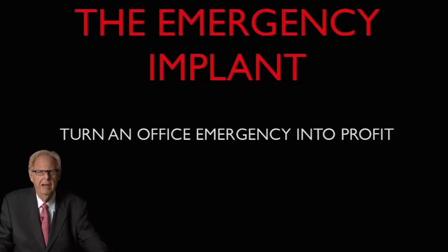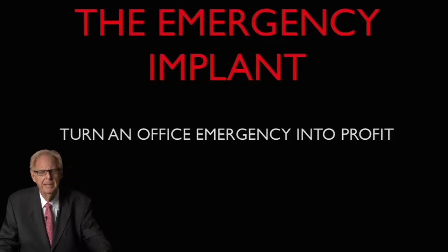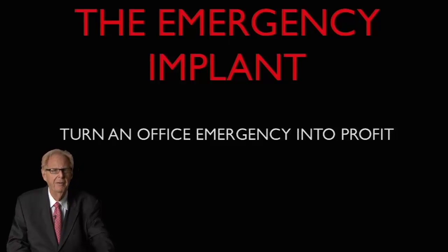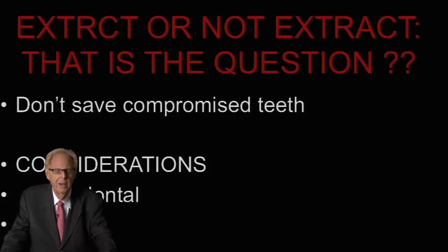So when presented properly, the implant option of a dental implant is the best option for that patient, because if you present a 3-unit bridge and tell them that you have to prepare adjacent teeth, or the possibility of wearing a flipper, which may alter the speech temporarily, generally the implant again is accepted, and basically you're taking an office emergency and turning it into a service that's going to result in profit. So in other words, the decisions that we make is extract or not extract, and that is the question.